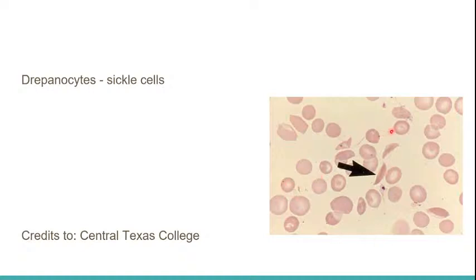Looking at the peripheral blood as well, you can see spherocytes here also, right? The lack of central pallor, right? And what else can we see here? Slits also, there's stomatocytes as well. Okay? So those are the things that you guys need to take into consideration when we're talking about RBC anomalies.